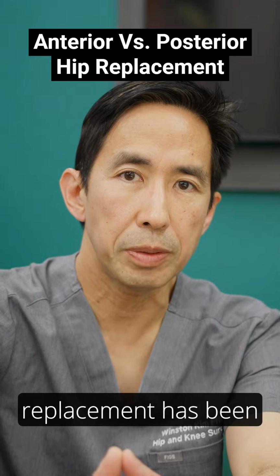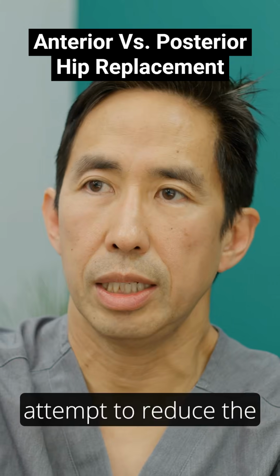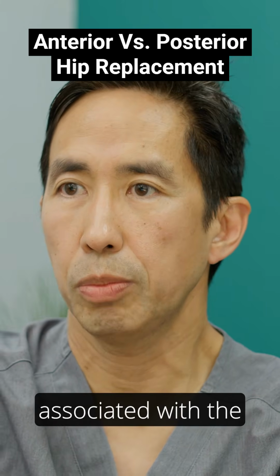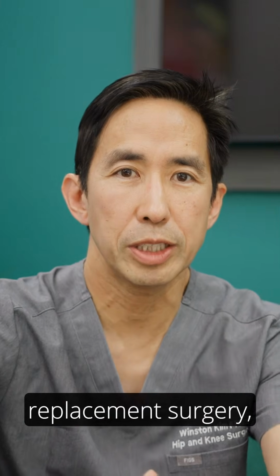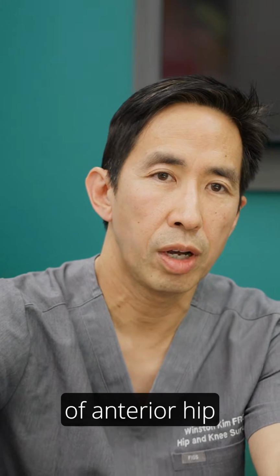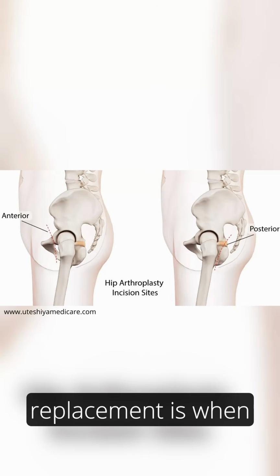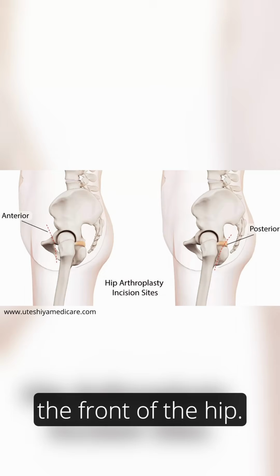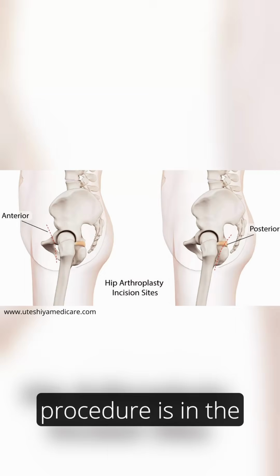The anterior hip replacement has been developed in an attempt to reduce the complications associated with the posterior approach. If you've done your research in relation to hip replacement surgery, you would have heard of anterior hip replacement and posterior hip replacement. Anterior hip replacement is when the incision is in the front of the hip. Posterior hip replacement refers to when the incision for the procedure is in the back of the hip.